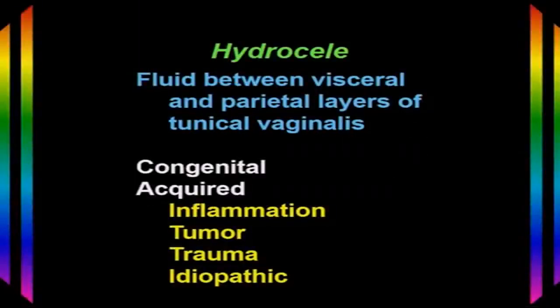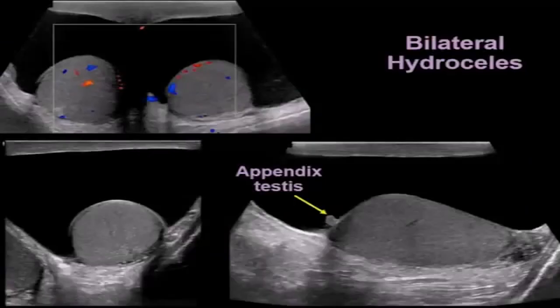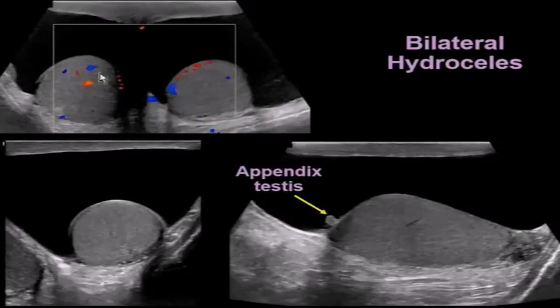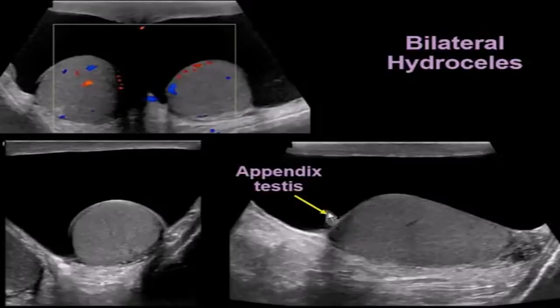Hydrocele occurs because fluid collects between the visceral and parietal layers of the tunica vaginalis. These can be congenital, but often they're acquired from inflammation, a tumor, trauma, or they could be idiopathic. Here's a patient with bilateral hydrocele — large scrotum with lots of fluid around both testicles with normal blood flow. In patients with hydrocele, you can actually see the appendix testis sticking off the testicle. This patient has a normal wide bare area with the testicle attached to the scrotal wall — not a bell clapper deformity.